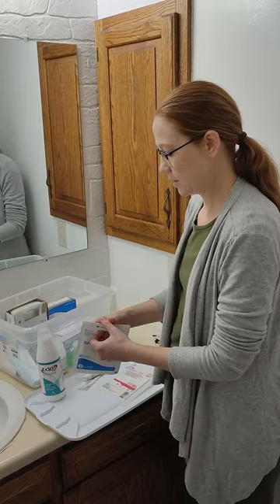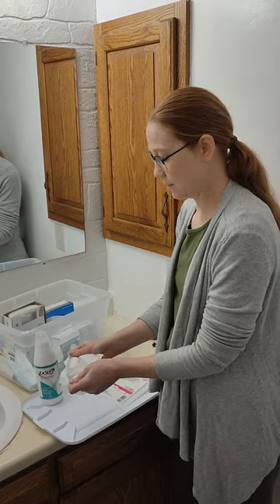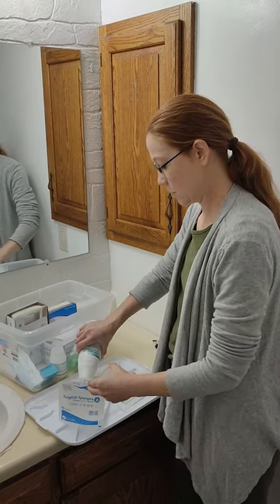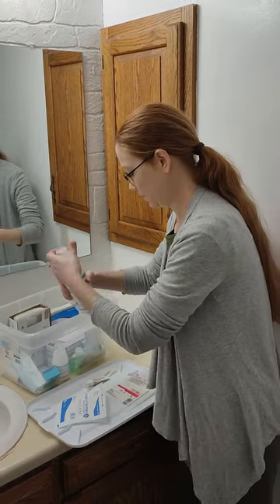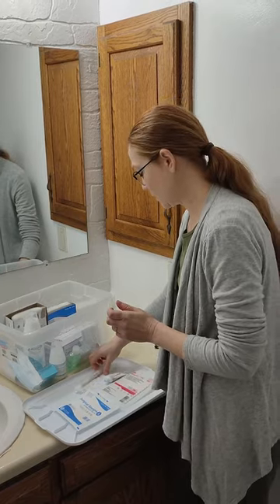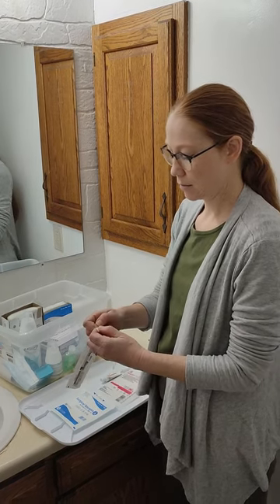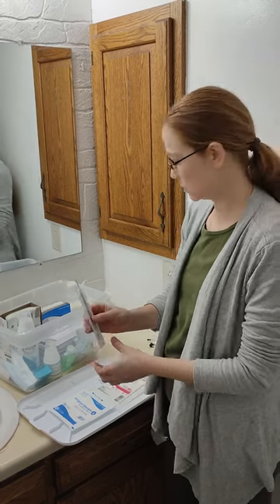First I open up the sponge here and I leave it in the bag — I just open it up. Get my Xcept and I soak them. And I just kind of let that sit there as I open up my other stuff that I'm gonna need. These come in packs of two and I only use one at a time, so I only open the bag partway so I can pull out one and leave the other one still in there safe.